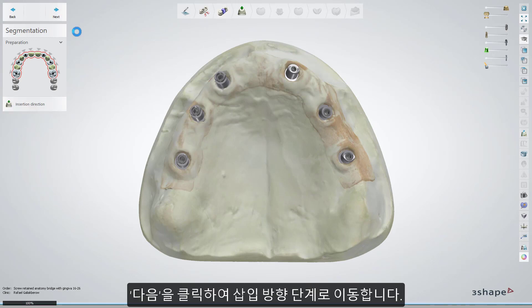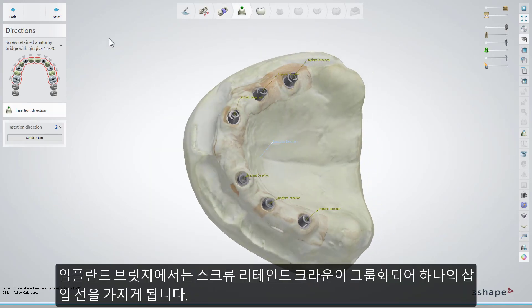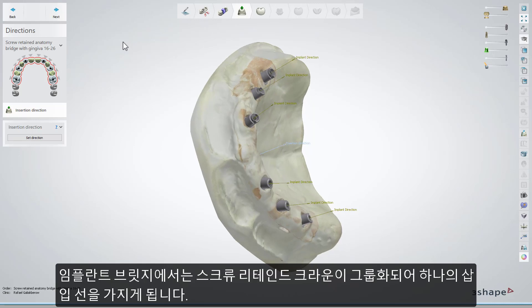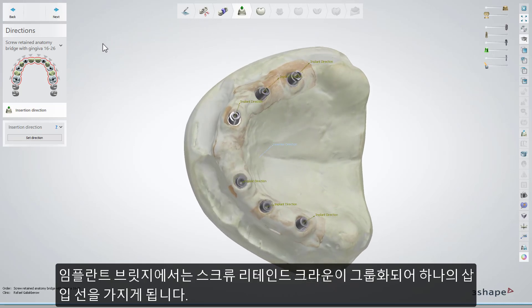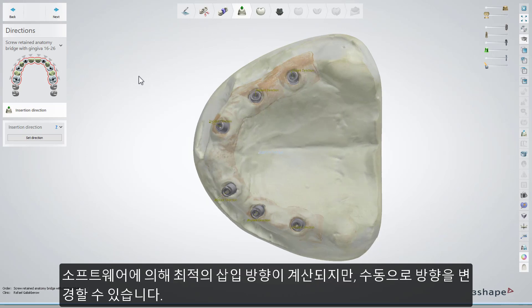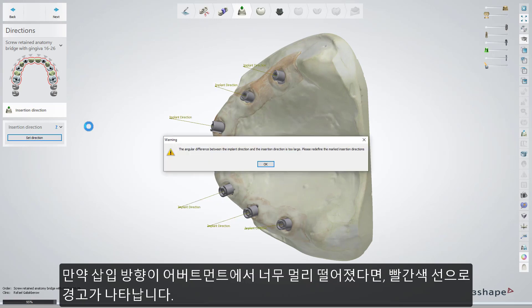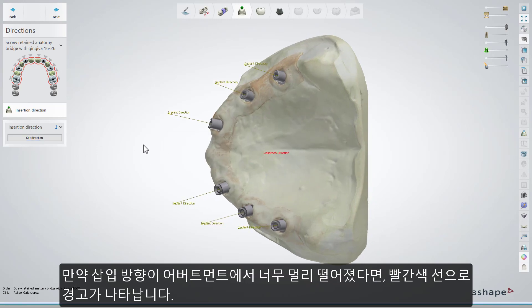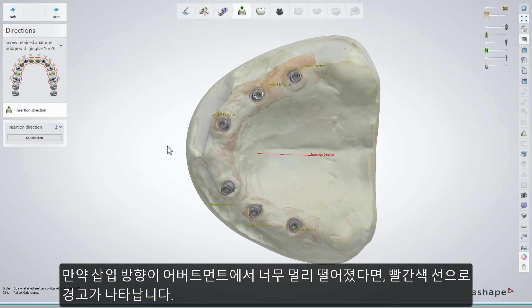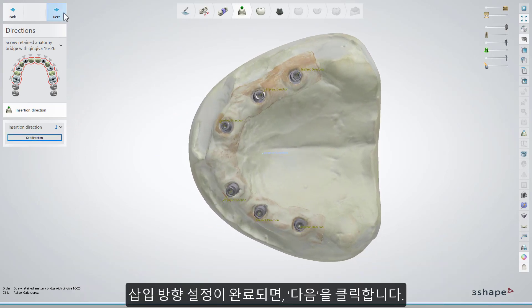Then click Next to move to the insertion direction step. In the implant bridge restoration type, screw retained crowns are grouped and have one insertion line for the restoration. An optimal direction will be calculated by the software, but you can modify it at this step. If it is moved too far for abutments, the software will notify you with a red vector and a callout. Once the insertion direction has been set, click Next.